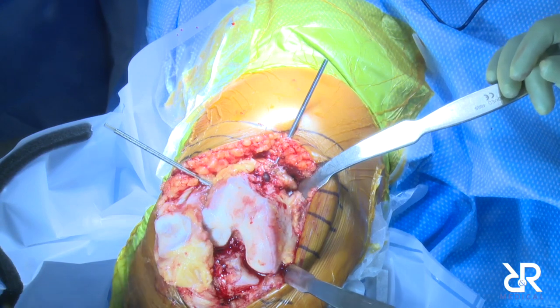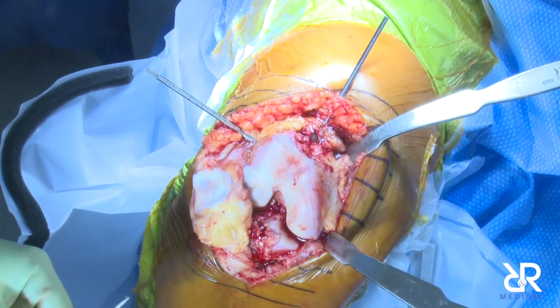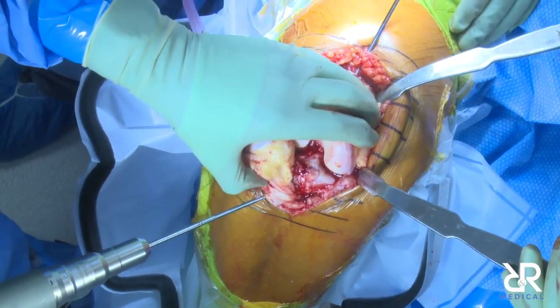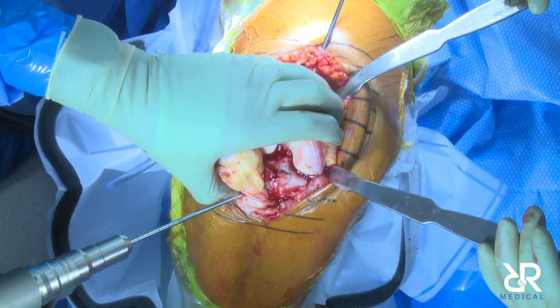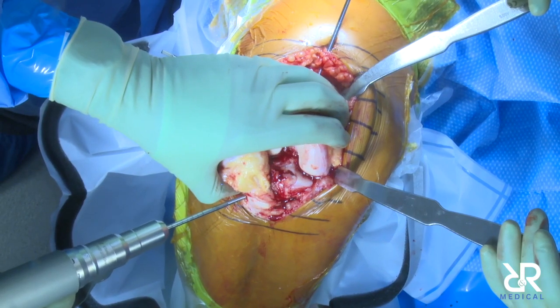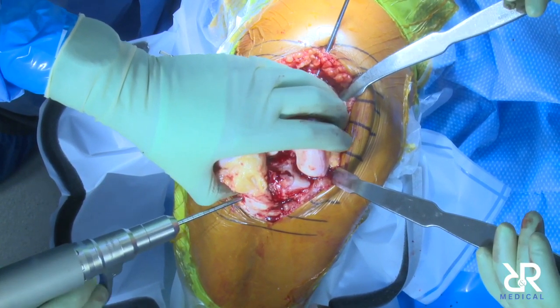It's a little bigger. I've not worried about the length of the incision at this stage, because you want to make sure you put the stuff in right. I mentioned that before you came on board. True minimally invasive surgery will require robotics because you've got to put the stuff in right. We're not quite there yet, but I think in the future that's where we're going to end up.